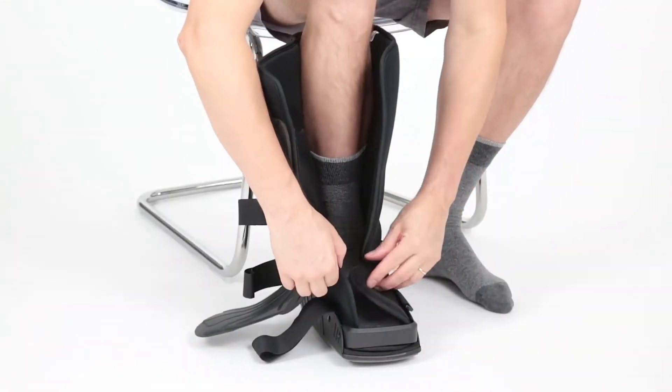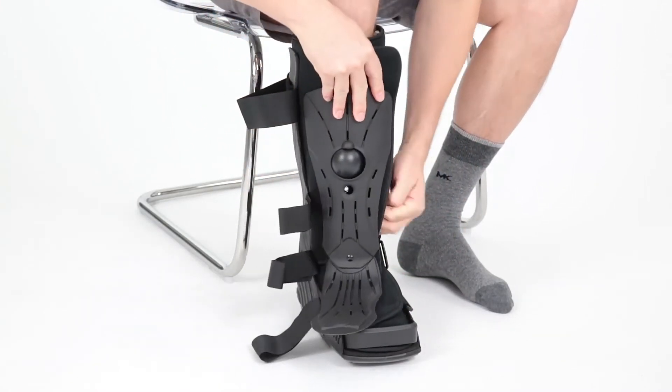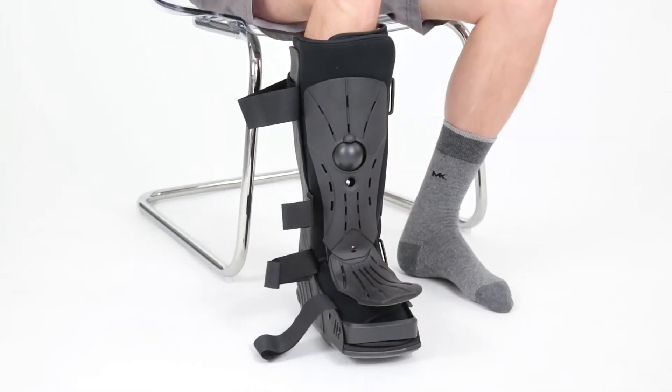With your foot inside the liner, secure the bottom strap then the top. Make sure your heel is positioned completely back.